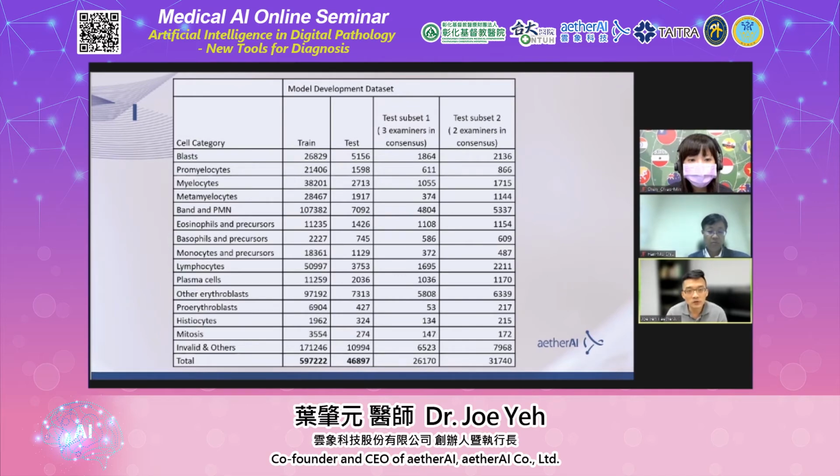So we have used a training set of close to 600,000 cells. In this project, we have a special design in terms of the test set. There are 46,000 cells in the test set, which are triply annotated. When we look at the testing set, we found something rather interesting. If we look at the consensus rate, we found that only 26,000 cells have consensus from all 3 examiners for the testing set annotation.